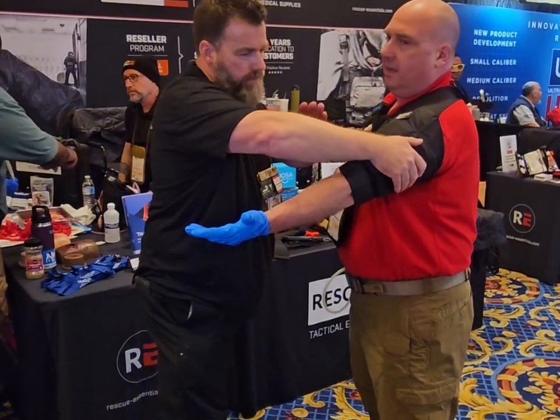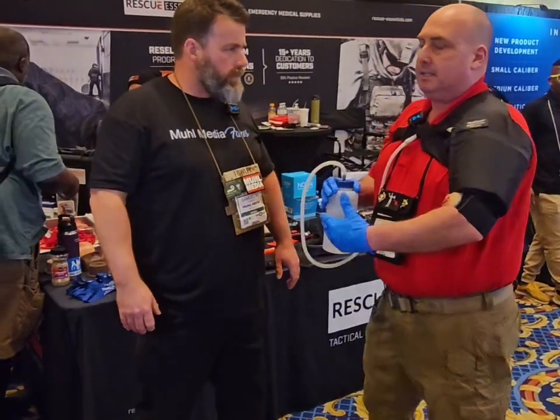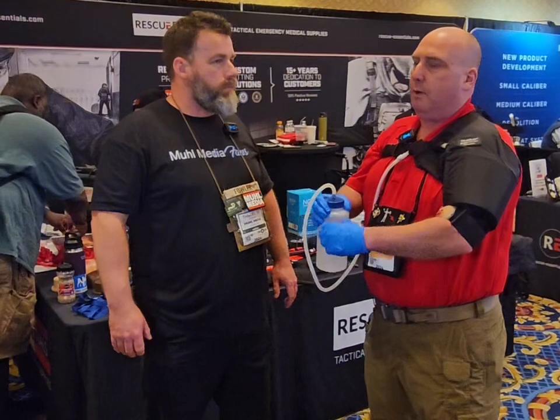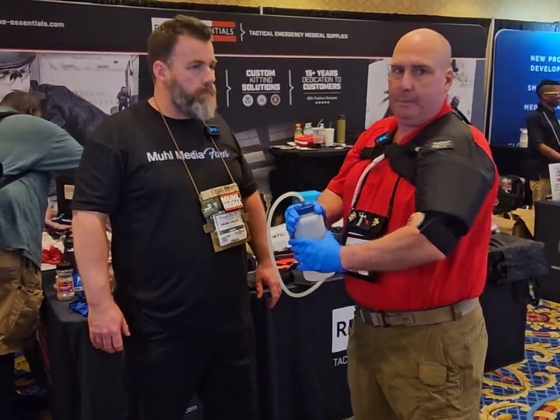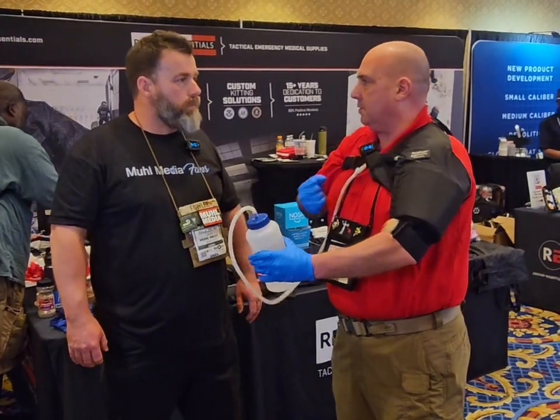The right way is: Sam is not releasing pressure off the wound — he holds pressure — and you have to unloop the tourniquet out of its set-up, then run it up, over, loop it, and lock it out.